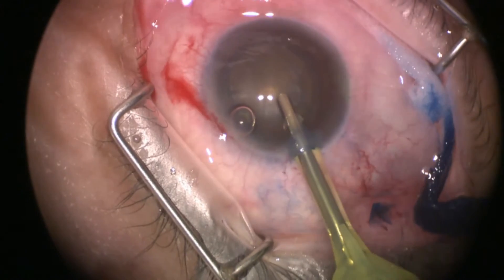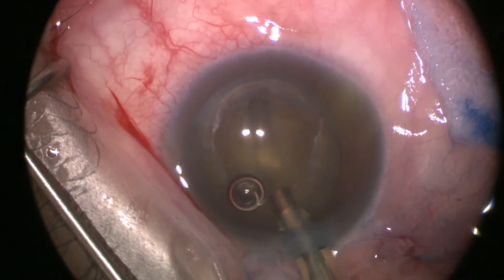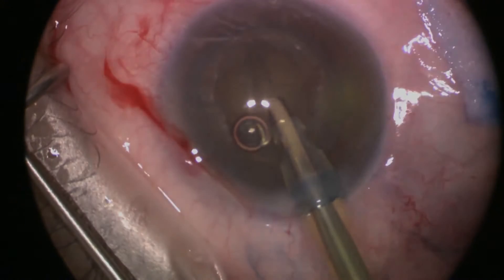Moving on to grooving the lens, you will now be using the FACO probe. The FACO probe is a very critical instrument. Use it in the proper way and it will be a very useful assistant that will get you safely to the end of the procedure.